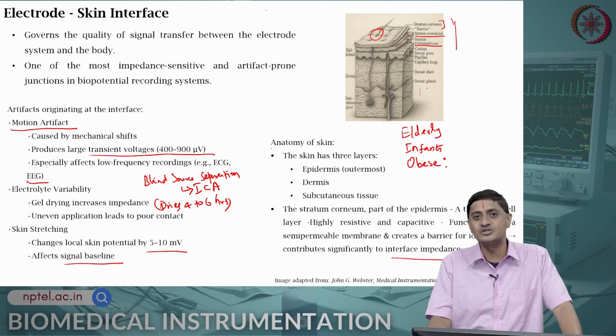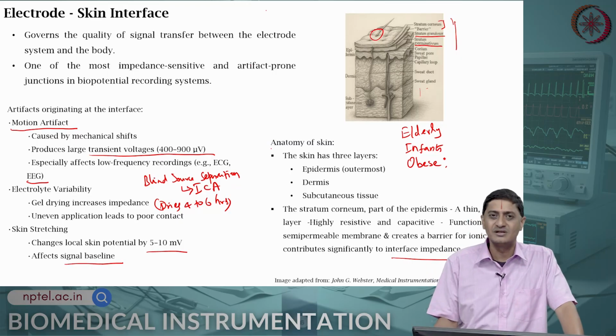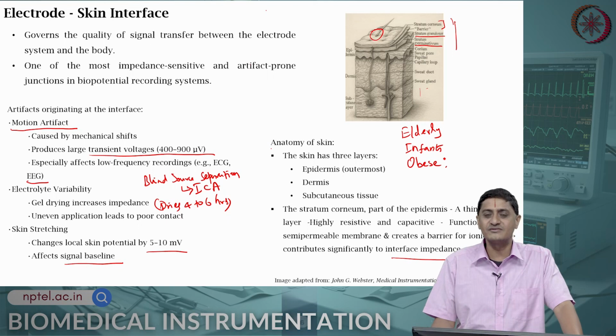So, patient comfort needs to be balanced, but at the same time you are also interested in having a high quality signal. You want to have a high quality signal. To the extent possible, you do not want to cause major discomfort to the patient.